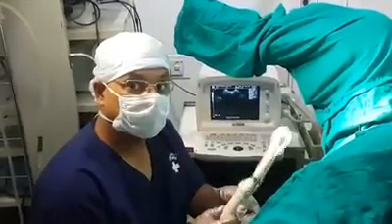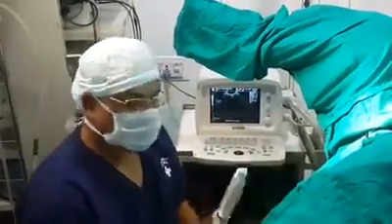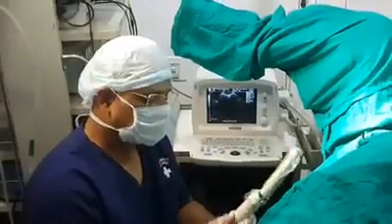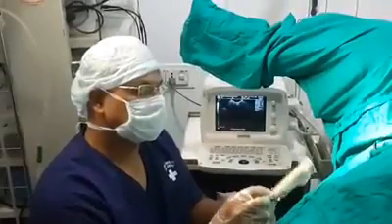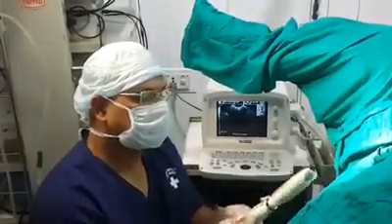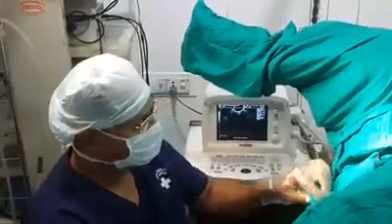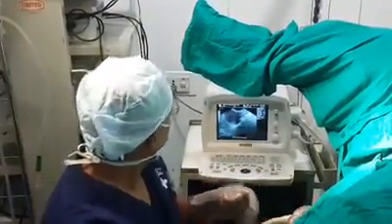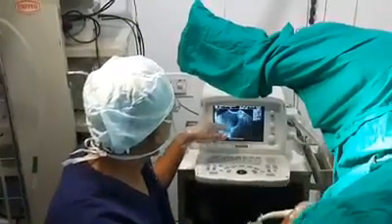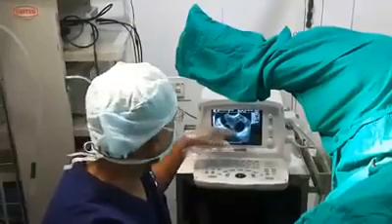This is an IVF procedure. I am doing ovum pick-up today of a woman. This is the ultrasound vaginal probe and I have put a needle guide for the needle which goes inside the vagina. I am putting this probe inside the vagina. Now you can see this is the uterus and these are the follicles. These follicles have eggs.